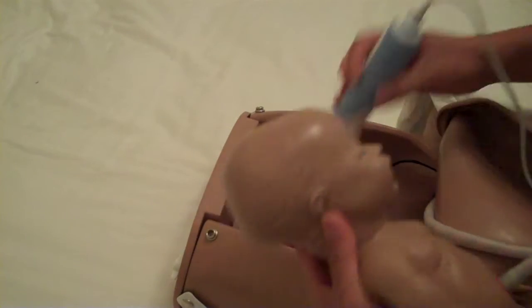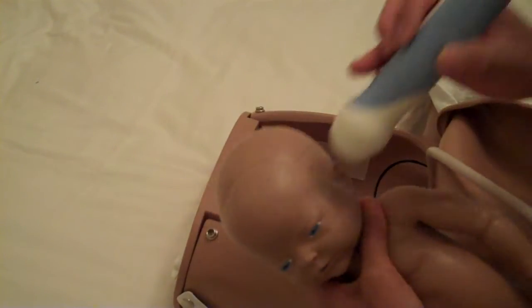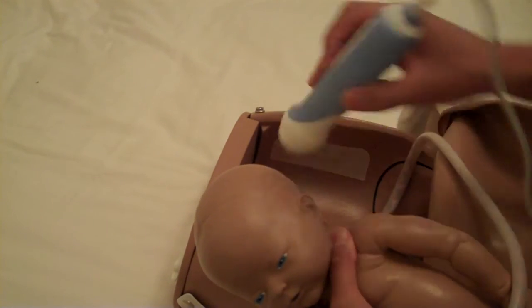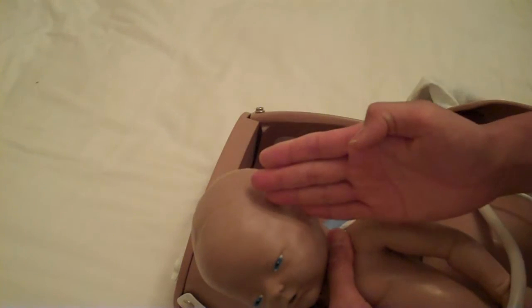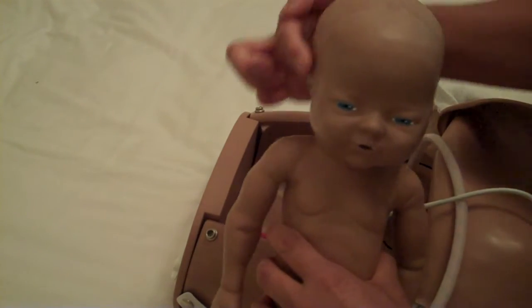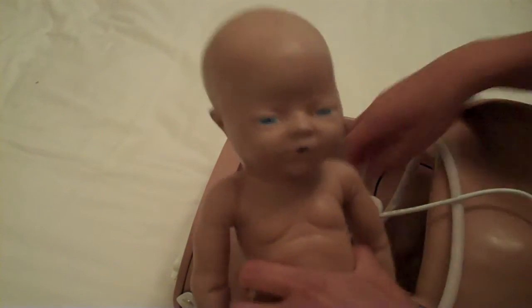Now, what if we were to scan like this? Or actually, I'm sorry, let's turn the baby this way. Scan like this. If we're to scan like this, dot pointing up, we're going to be cutting it this way. So we're going to be getting an outline image this way, so you will not be able to see the nose, mouth, and all that, okay?